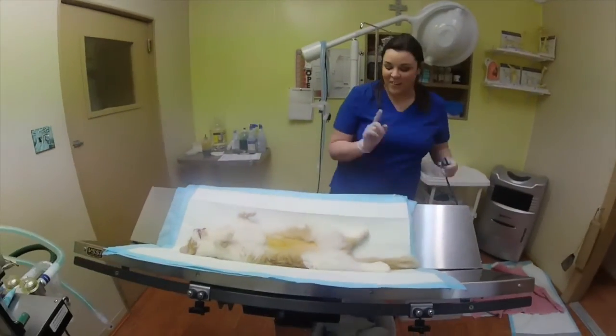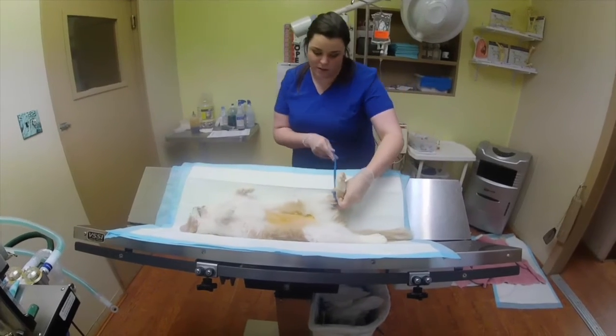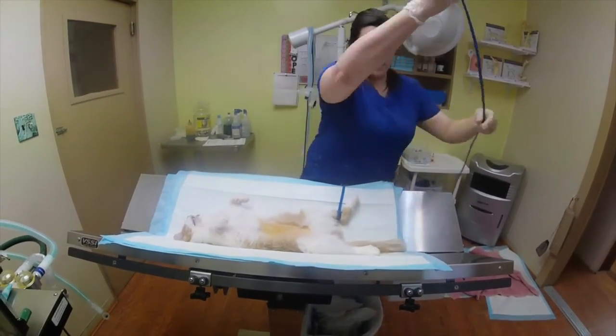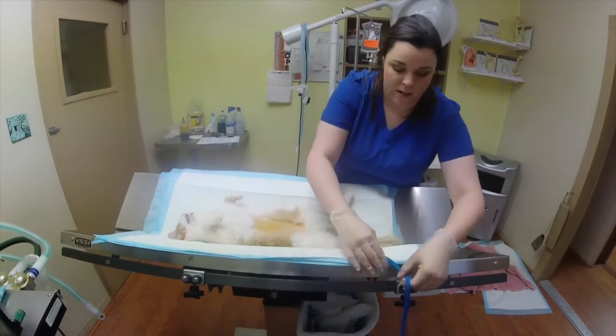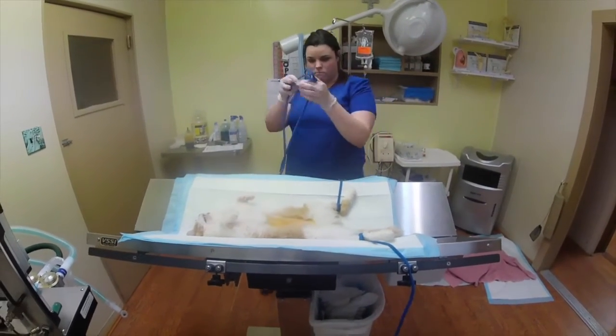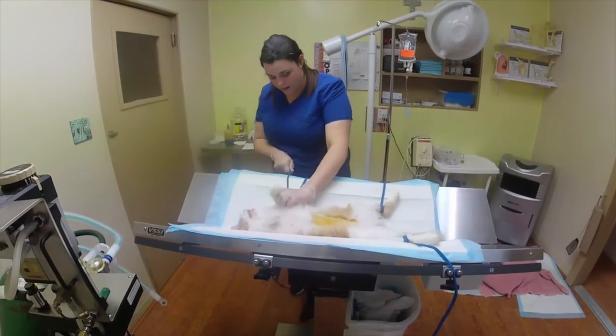Okay, so we're going to tie in our patient to make sure she doesn't get off the table or go anywhere. And that way the limbs don't get in the way for the doctor. You're going to be very careful not to contaminate any of your surgical site. These are just strings, rope leads to tie the cat down.